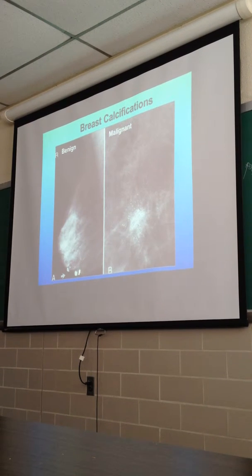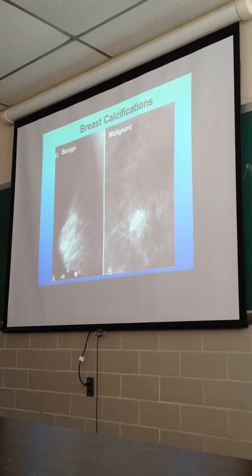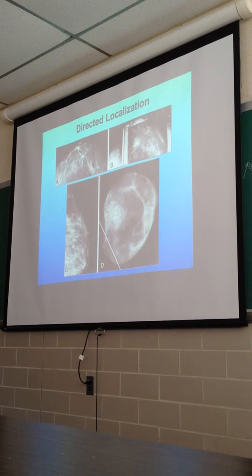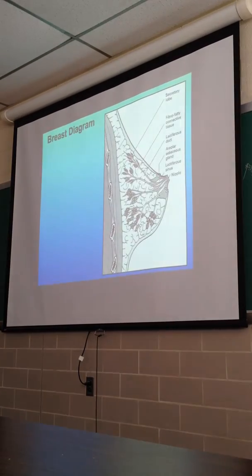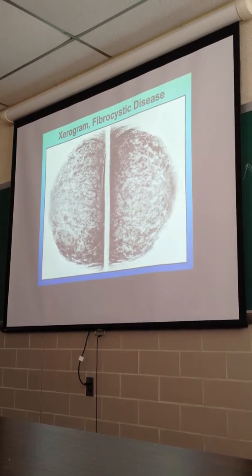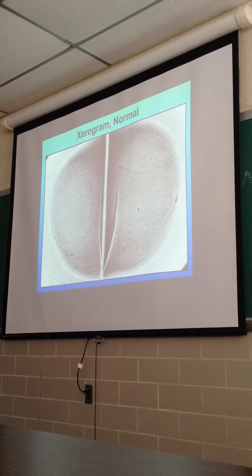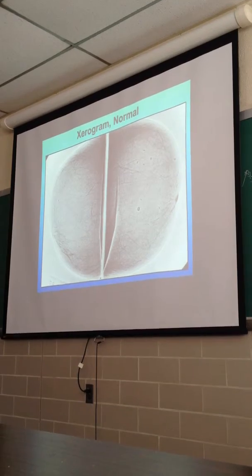Can you tell the difference between benign calcifications and malignant calcifications? What we call malignant calcifications. Dr. Mario, are those also called microcalcifications? Microcalcifications, right. So micro is always malignant? Not always, because they can also occur with carcinoma in situ. Okay.